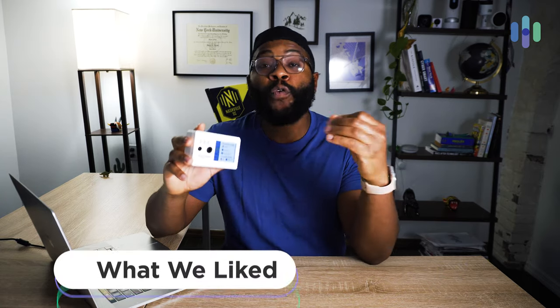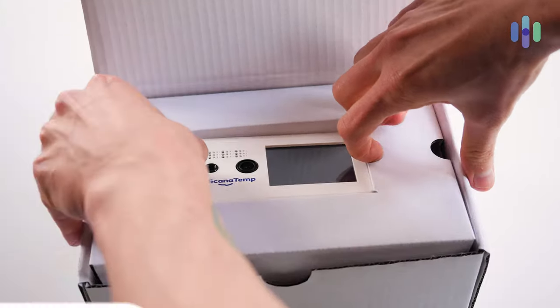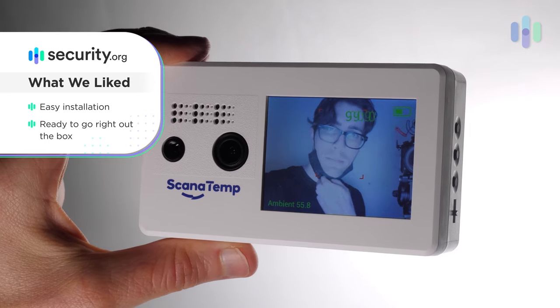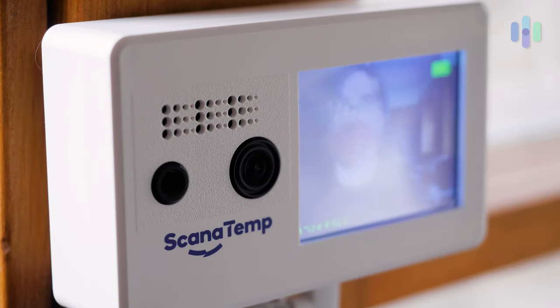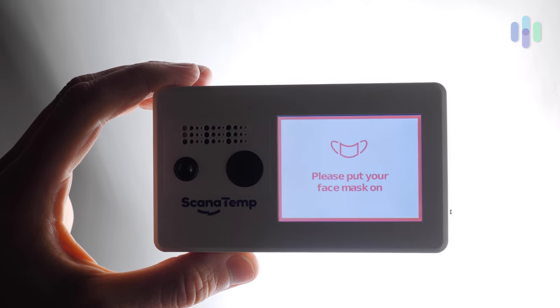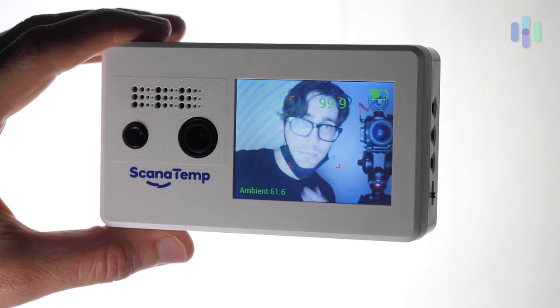Let's kick off today's look at the Scan-a-Temp Rapid Temperature Scanner and Mask Detector. What we liked: right off the bat, it does exactly what it says it's going to do. It comes out of the box and immediately starts telling you whether or not your temperature is within the parameters you've set and whether or not you're wearing a mask. It does so with visualization and also with actual audio messages — a voice recording that says 'hey, you're not wearing a mask' or 'your temperature is too high.' Your temperature is normal. Please put your mask on.